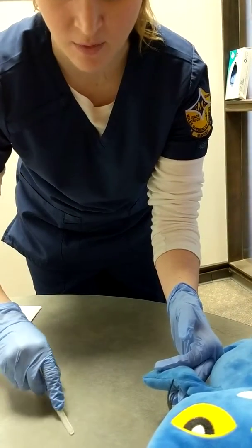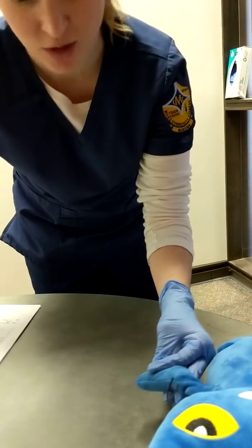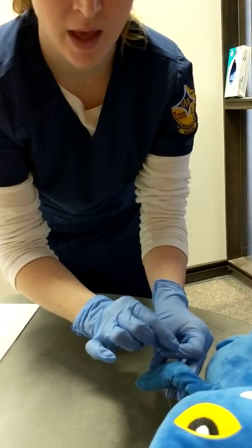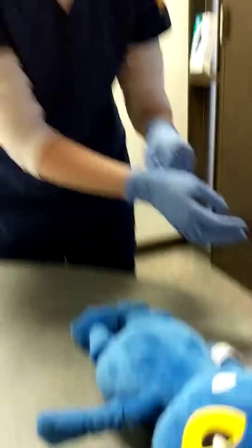I'm going to safely recap this one because we don't have a sharps container in the room, but we would dispose of this in a sharps container. We would draw a marker around our bleb so that we could note if there's any reaction. We could dab this, but we don't want to cover this with a Band-Aid because we want to be able to see the reaction. We don't want to risk there being any other reaction with adhesives. So we'd mark this. Remove gloves, dispose of all of our goods, and we're going to document.